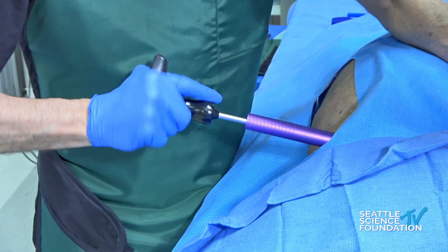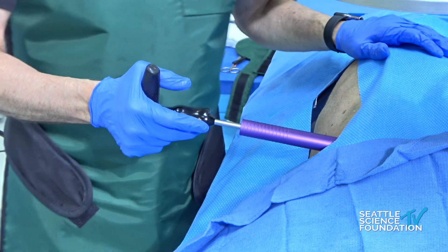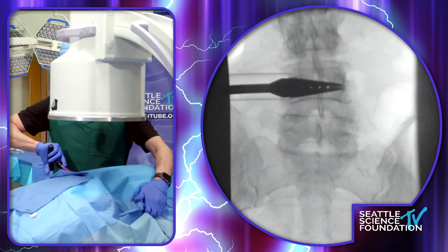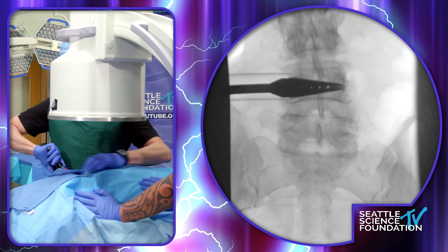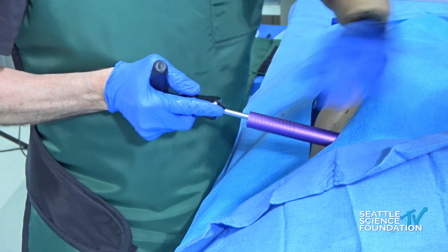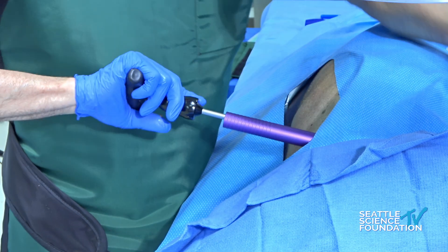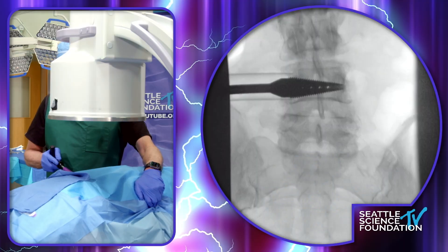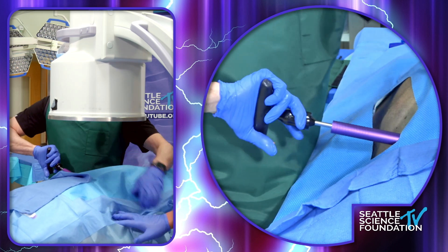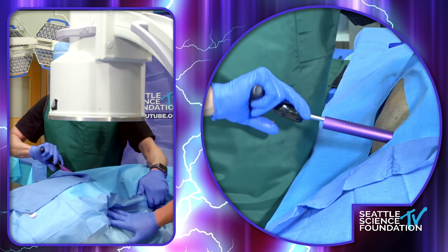Anything with power tools involves that — or with a lot of elbow grease. You can see I'm putting quite a bit of pressure on this, and this goes with the graduated tap and any of the larger screws. You can see the holes right there. The first hole on the tap represents an 8, the second hole represents a 10, and the third hole — which is kind of my goal for this to show you a real procedure — is a 12-millimeter interspinous spacer. We reach the 12, and just like the rule with the VertiFlex, you should really upsize just a little bit more to be able to get the 12-millimeter implant in.